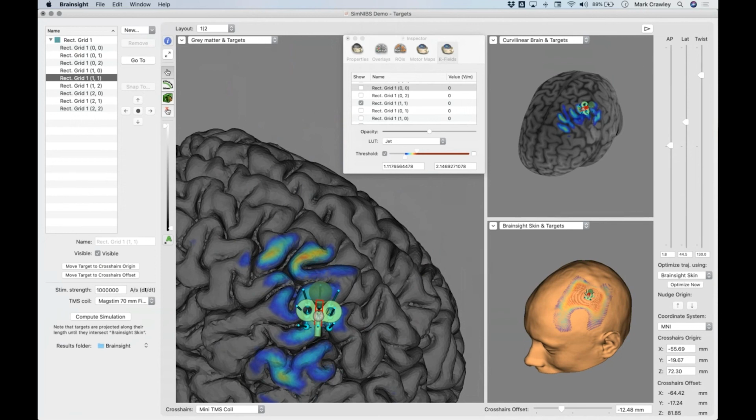Yeah. And then this one, I tried to answer it myself, and then Rox actually got a very cool answer to this, but I think people have been screaming out for it for a while now. Cool. Regarding SimNIBS, can you simulate the E fields only for the standard definition files? Or, as in the case for SimNIBS, unless you have a special coil definition file? Or does a simulated field depend on the actual coil position? And what was Rox's answer?